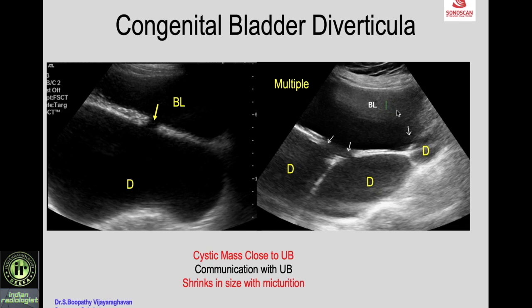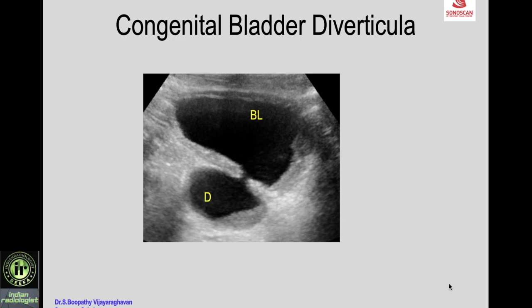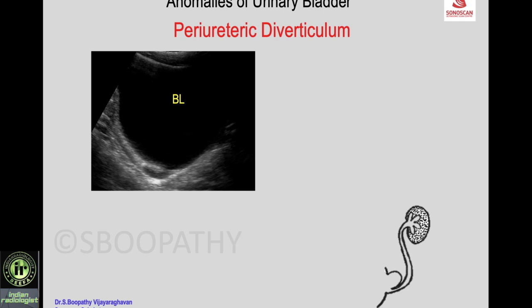The diverticulum can be multiple, as seen here where the bladder shows multiple cystic masses each communicating with the urinary bladder. A complication of vesical diverticulum is infection, which can be seen as debris within the diverticulum.